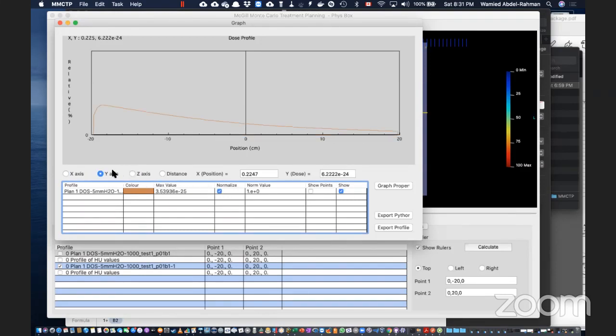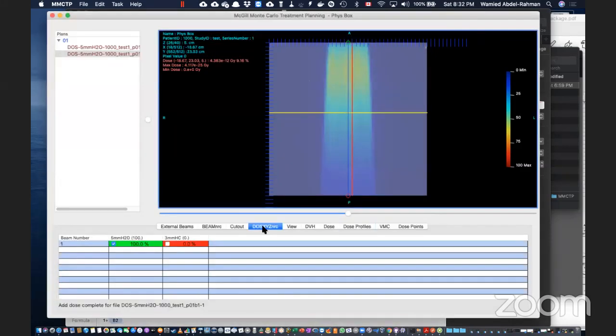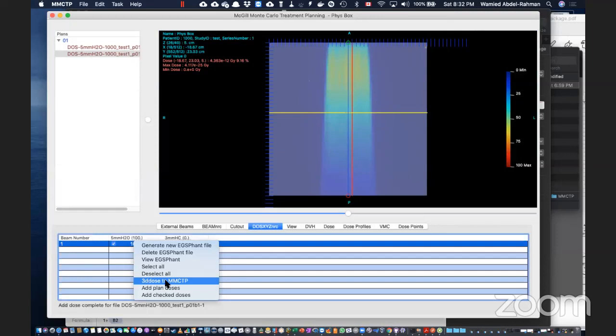Yeah, I see what you mean. Anyway, this is something I will look into, and the last point is how did you remember you added something to the commissioning? Oh, today you mean? Yes, today. So you had a commissioning table for outputs, and you were assigning values.